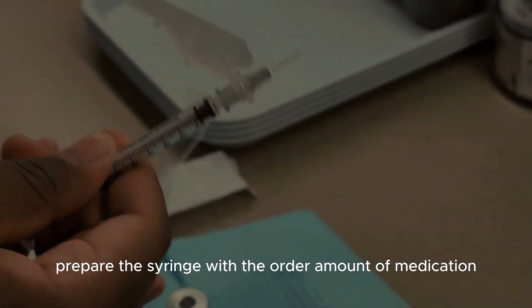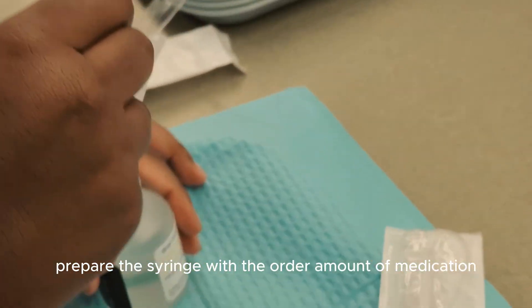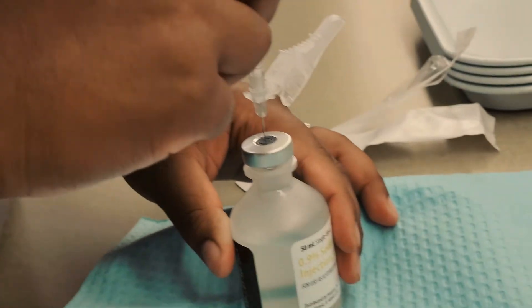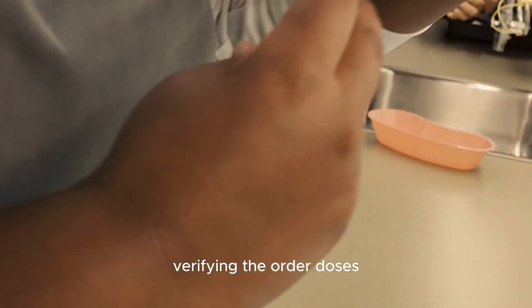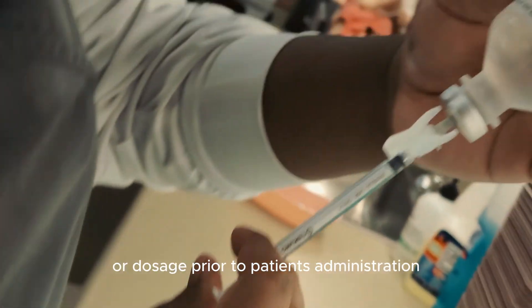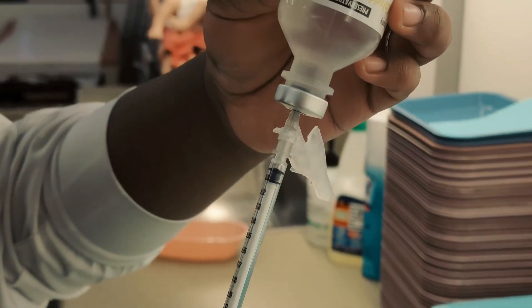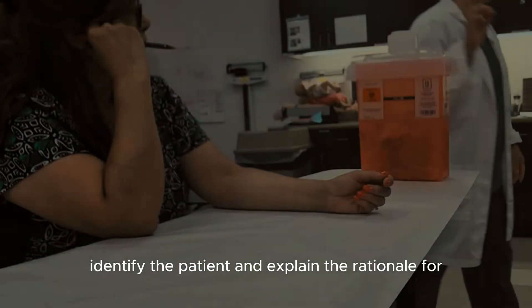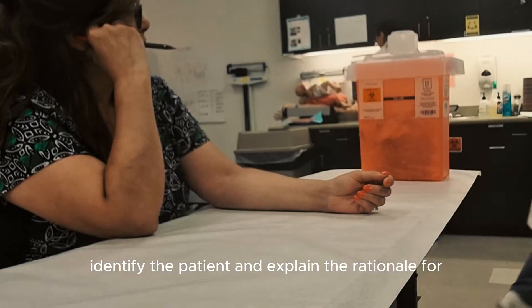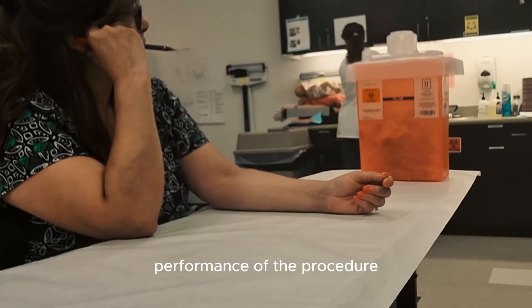Prepare the syringe with the ordered amount of medication, verifying the order, dose, or dosage prior to patient administration. Identify the patient and explain the rationale for performance of the procedure.